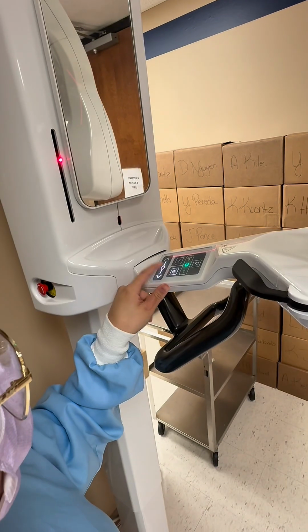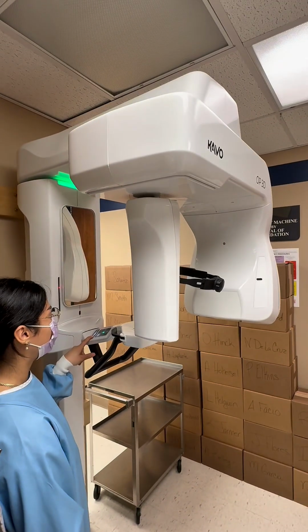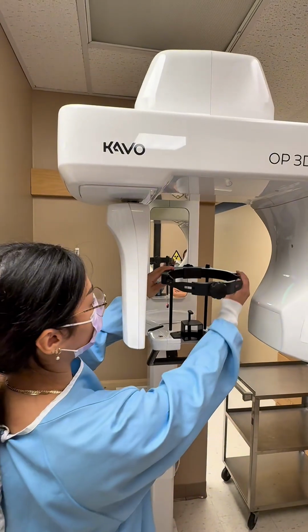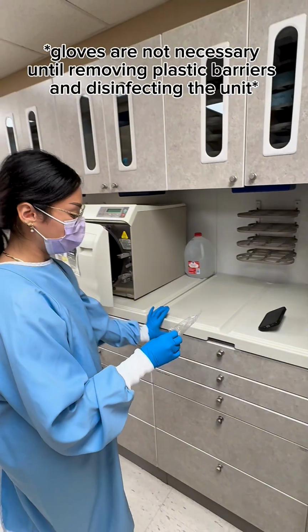Next, prepare the pano machine for exposure. Begin by lowering the machine closer to the patient's height. Open the temple and forehead supports, then cover the bite block using the proper covers found in the designated drawer.